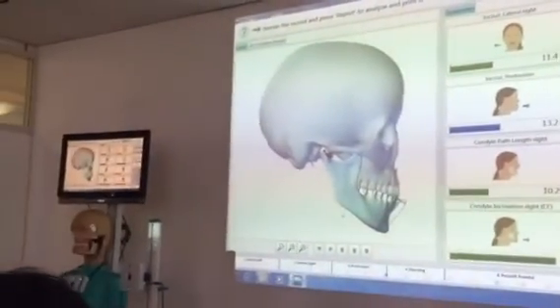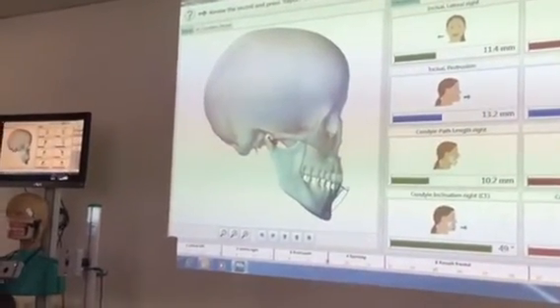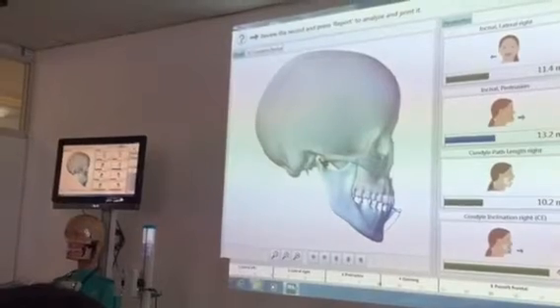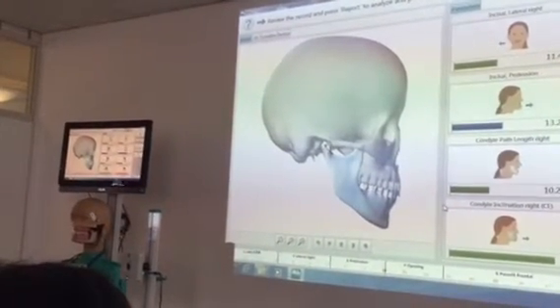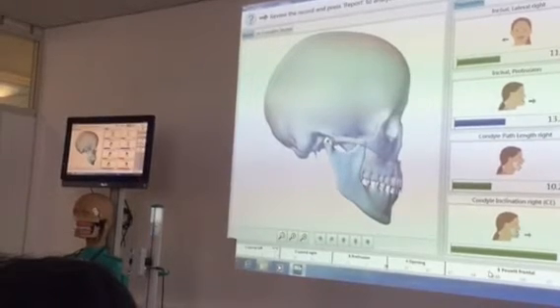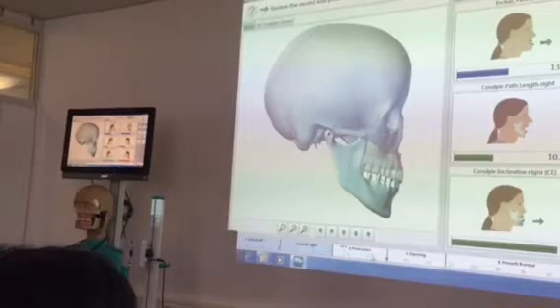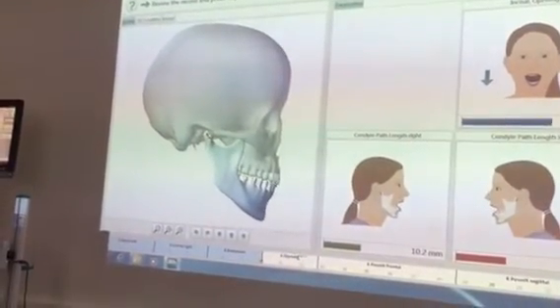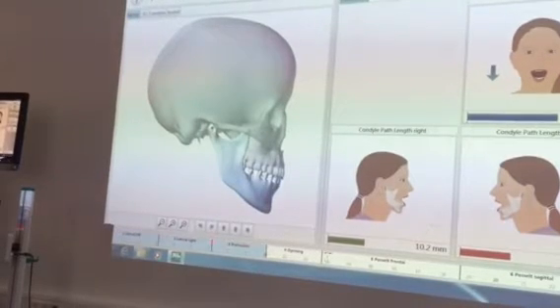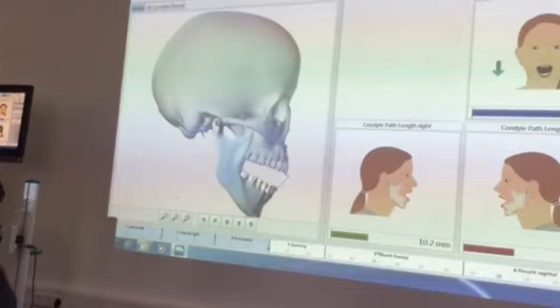Same as in the software with a treadmill, we can follow up the movement that I did, and I can switch different movements off and on here. Now it shows only opening, and this is now switched off by double click.